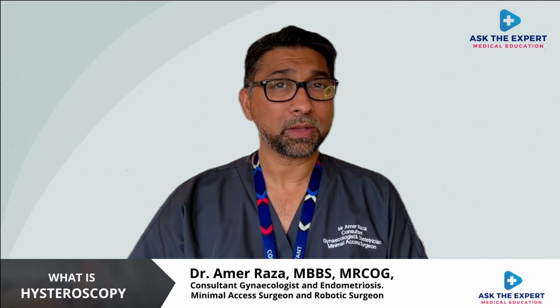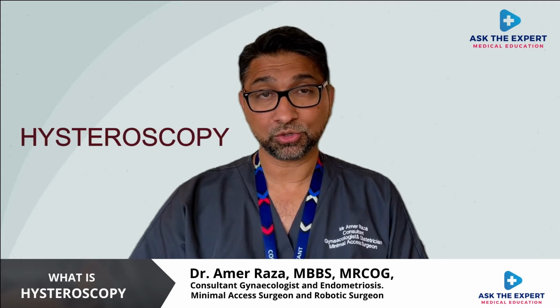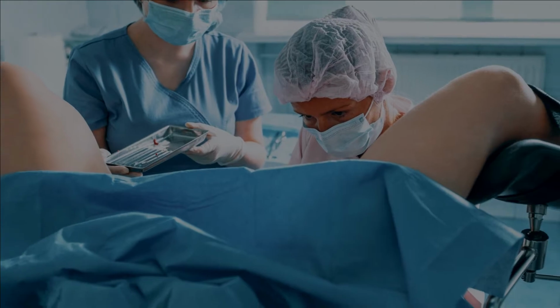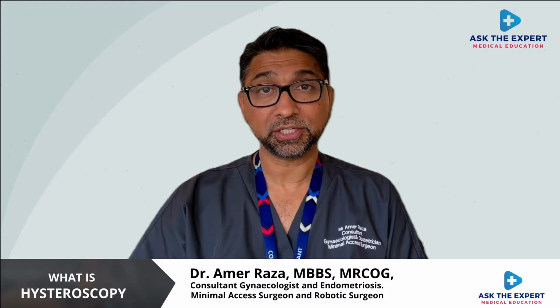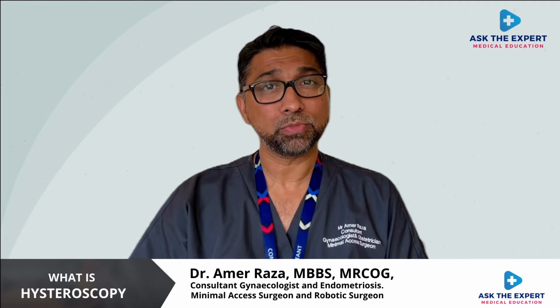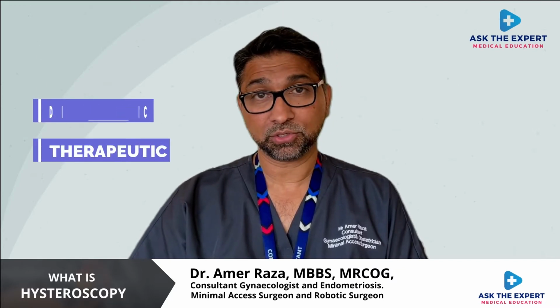Today I'm going to talk about a very common procedure carried out in gynecology clinics and gynecology departments, hysteroscopy. Hysteroscopy is a common procedure which is carried out to check and diagnose problems inside the uterine cavity and also treat them. I can broadly divide the indications for hysteroscopy into two main groups. One is diagnostic and the other is therapeutic.